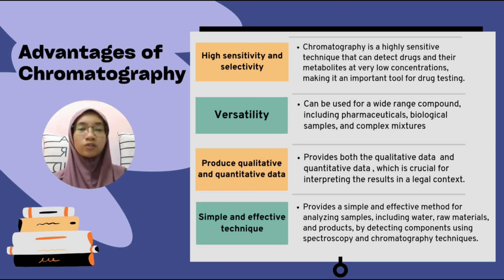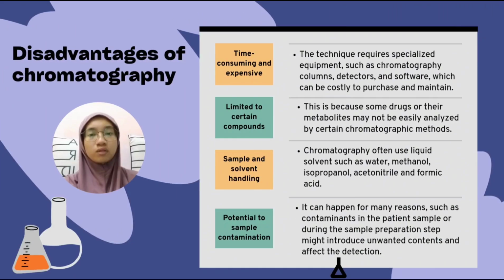Lastly, chromatography is a simple and effective technique. It provides a simple and effective method for analyzing samples, including water, raw materials, and products by detecting components using spectroscopy and chromatography techniques. Next, I will explain the disadvantages for using chromatography.